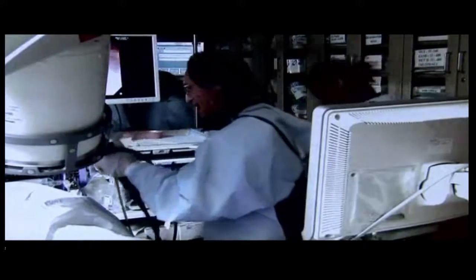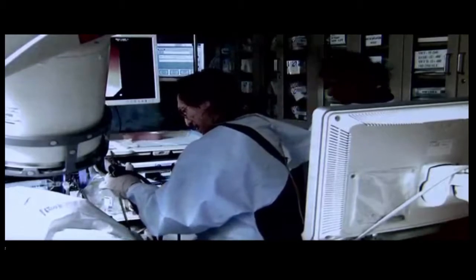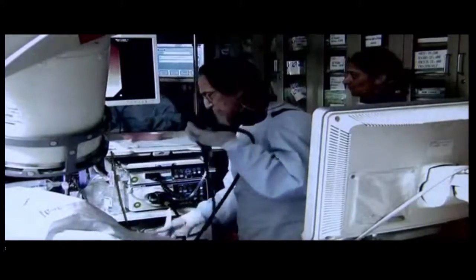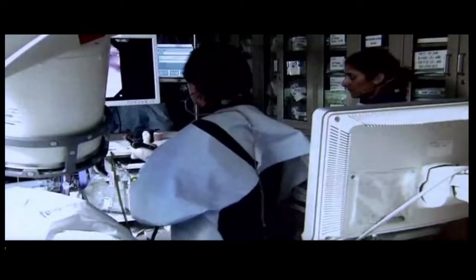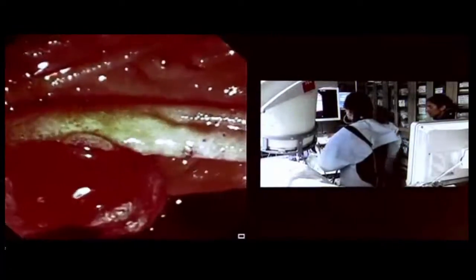So what I can tell you from experience, having done a lot of ampullectomies, is that stenosis of the pancreatic orifice is not that uncommon. I've seen it a few times. Usually we don't do a pancreatic sphincterotomy, but we'll place a pancreatic stent to prevent pancreatitis. But after ampullectomy, there's a risk of that opening, despite that stent, of stenosing down.